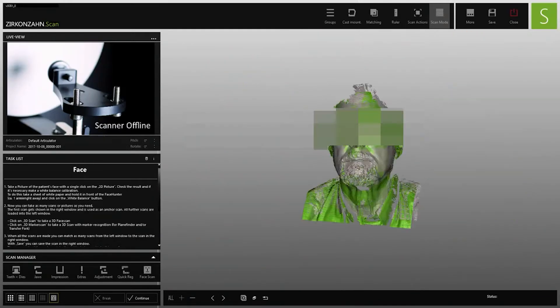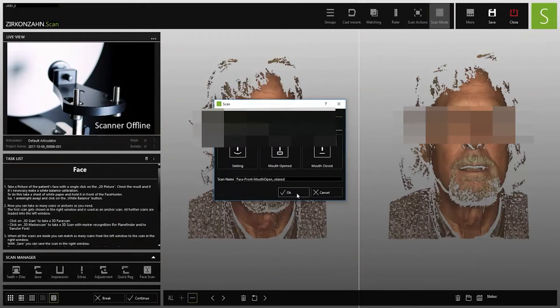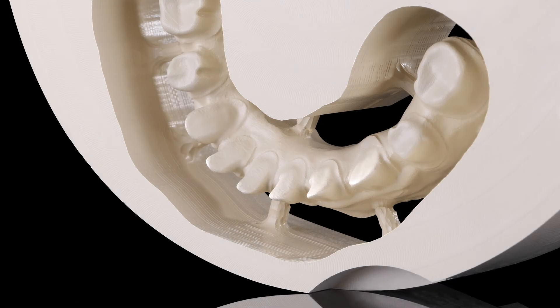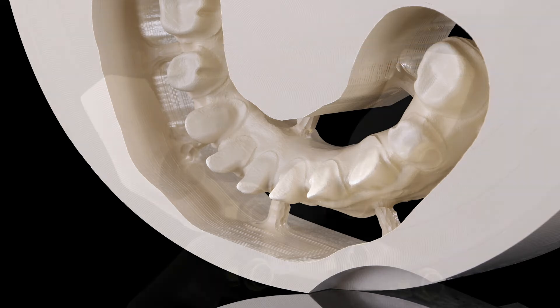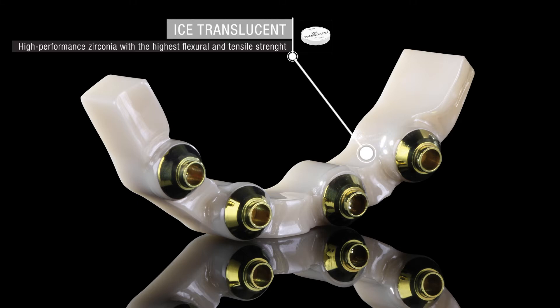The digitization of the patient situation was then used as the basis for modeling the final restoration — a frictional hybrid restoration with a zirconia bar and crowns and a resin framework made of Techno Med Mineral Dentine. Based on the virtual setup, an ICE translucent zirconia bar with anodized titanium bases was manufactured.